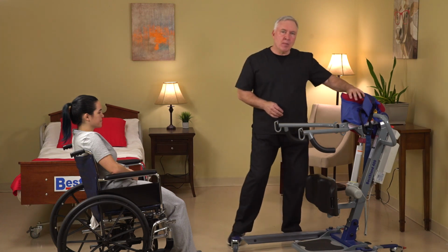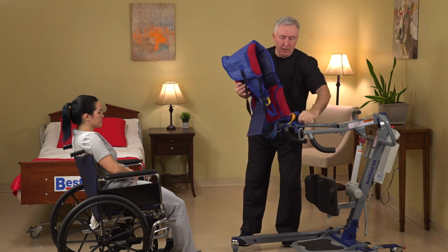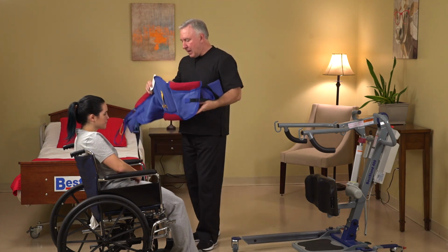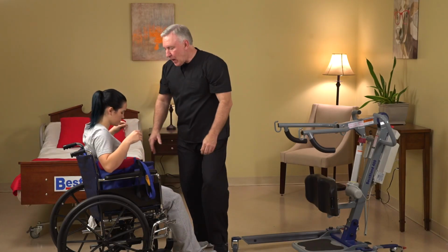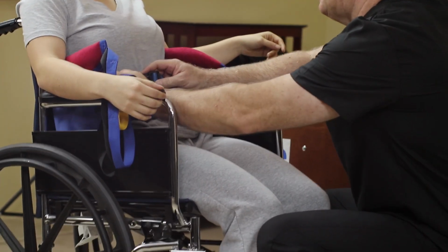So now let me show you how we can make the transfer for the patient from the wheelchair to the bed using our standard sit-to-stand sling. And we all know when we're using our sit-to-stand slings, we have to place the sling behind the patient's back. Bring the waist strap around the patient's waist, tighten it up and secure it.